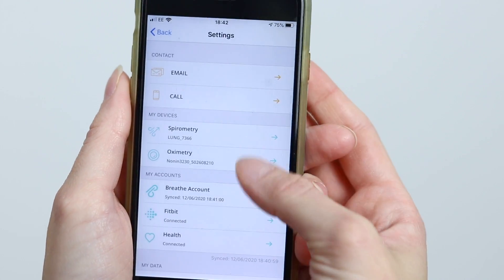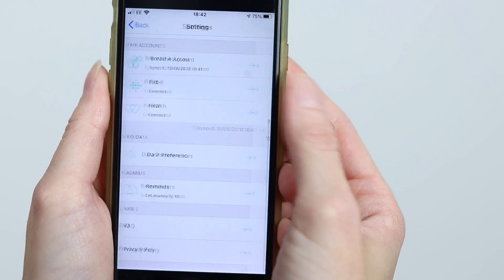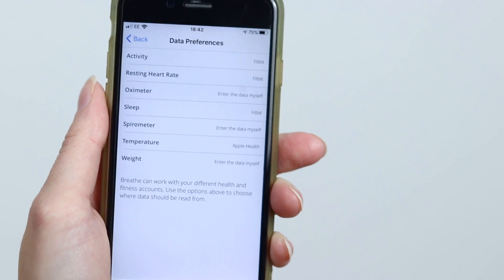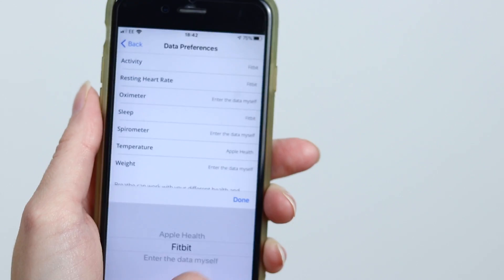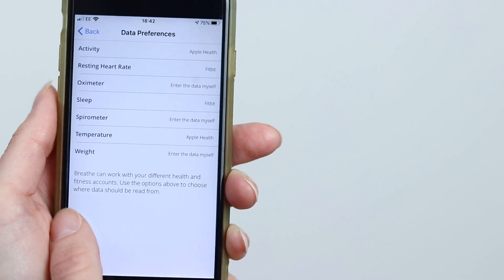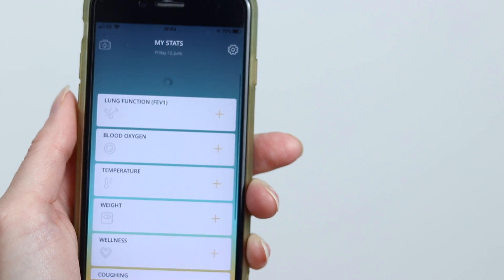If you can see your data in Apple Health but not in Breathe, open the Breathe app and go to Settings. First check that Health is connected — it should have a green icon and say it's connected. If that looks okay, go to your Data Preferences page and make sure the measures you want Breathe to pull from Apple Health are correctly selected. These can be changed by tapping on the selected source and updating if needed. Once everything is set up, return to your home page, pull to refresh, and hopefully you'll now see the data you expect in your Breathe app.